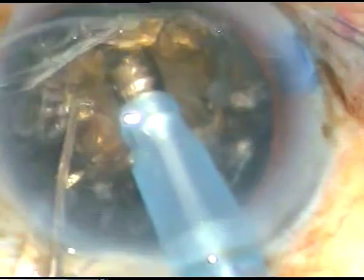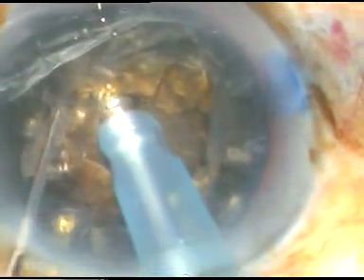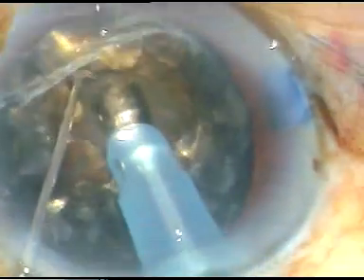And after that, my plan is to start chopping this. Now I am in Phaco 2 mode. Phaco energy is 95% — yes, the same, 95% phaco energy. Flow rate at this time is 45 ml per minute and vacuum is 450 mmHg. Flow rate and vacuum I don't change much in surgeries — I just change the power. And I use continuous mode, not pulse mode, not micropulse mode. It is just continuous energy.